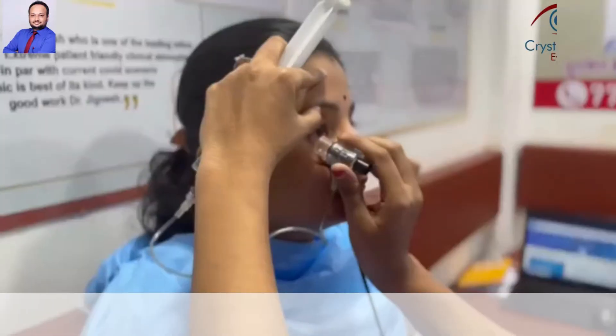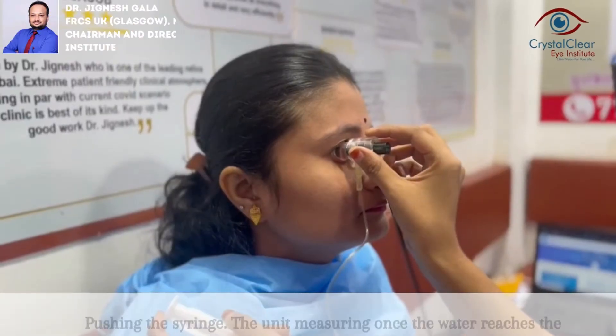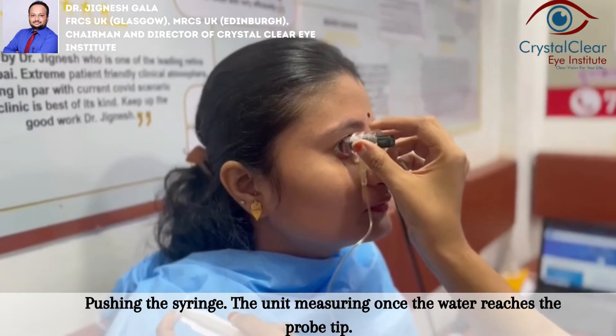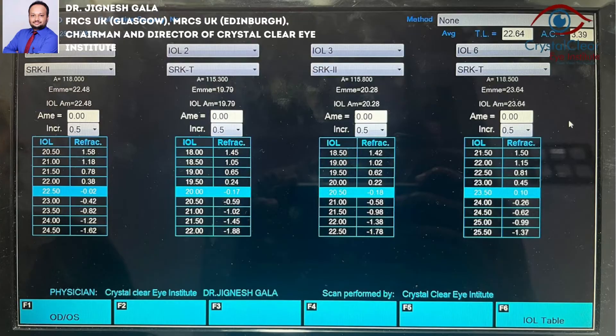The scleral shell is then filled with a 40-60 mixture of goniosol and dacryos, and the probe tip is placed into the solution. Align the ultrasound beam with the macula by having the patient look at the probe tip fixation light, then simply take your readings as usual.